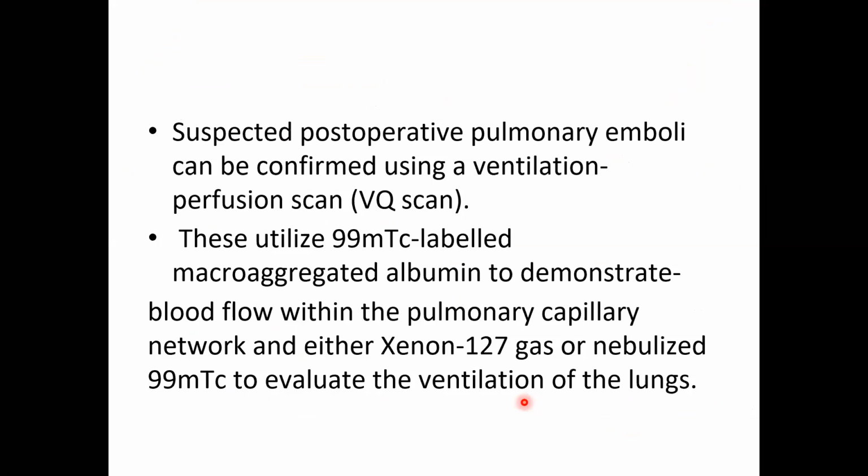Suspected post-operative pulmonary emboli can be confirmed using a ventilation perfusion scan, that is a VQ scan. These utilize 99mTc-labeled macro-aggregated albumin to demonstrate blood flow within the pulmonary capillary network, and either xenon-127 gas or nebulized 99mTc to evaluate the ventilation of the lungs.